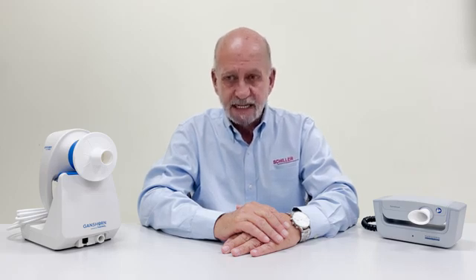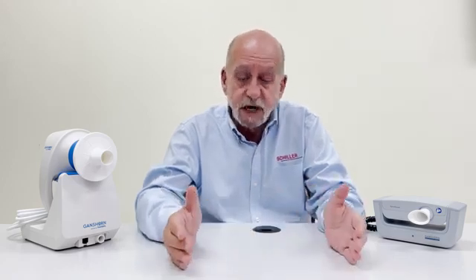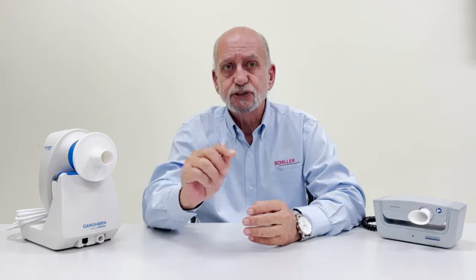Okay, it's not that one or the other is better or acts earlier. When we use spirometry, we consider negative results when the measurements are plus or minus 20% of the predicted value. So we have a very large range of measurements that can be considered normal, but maybe not exactly healthy directly. With oscillometry, we will have a more precise way of looking at how that ventilation is working.